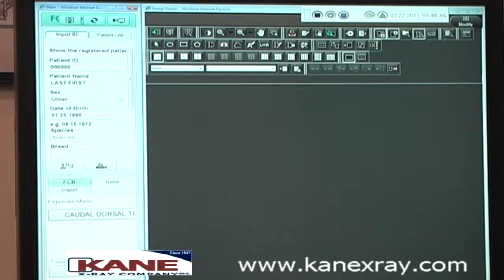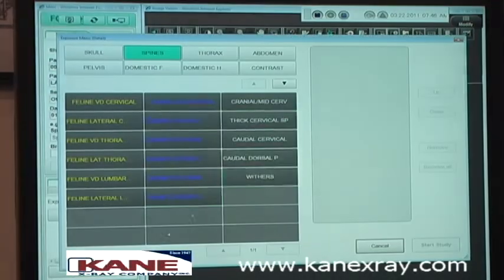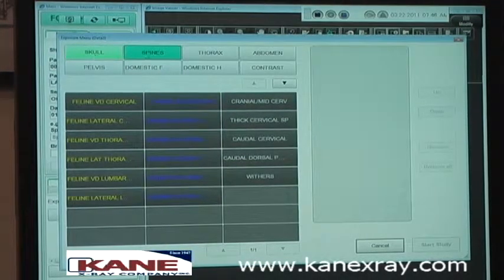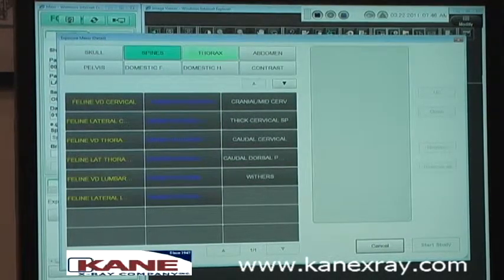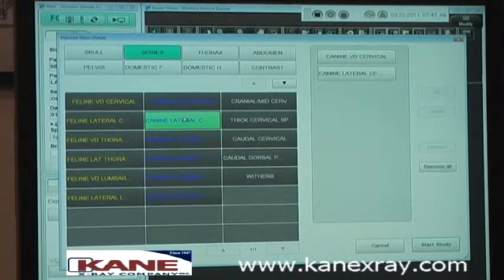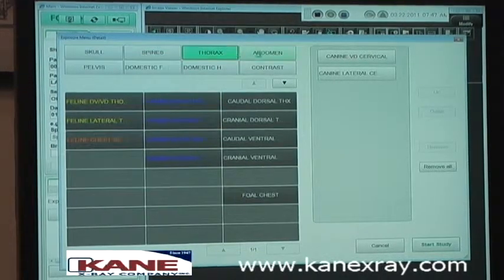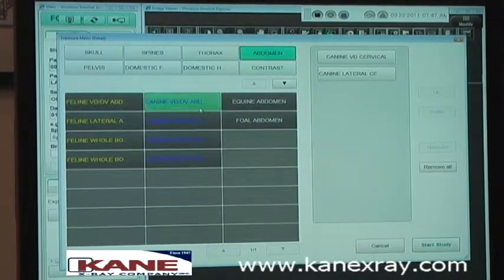After you've registered a patient, under the FCR tab you have exposure menus. You want to go to Others, and then you can select the anatomical region of the body that you want. For example, under Spine you can choose a cervical, a lateral, or any other anatomical regions you want — just scroll through and select those.